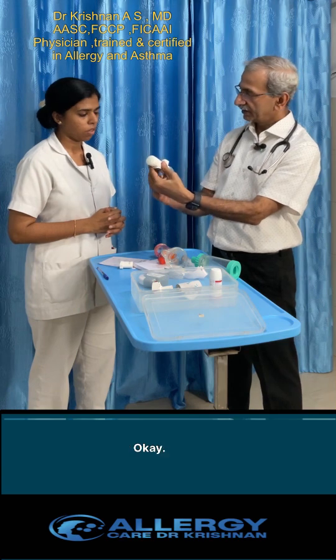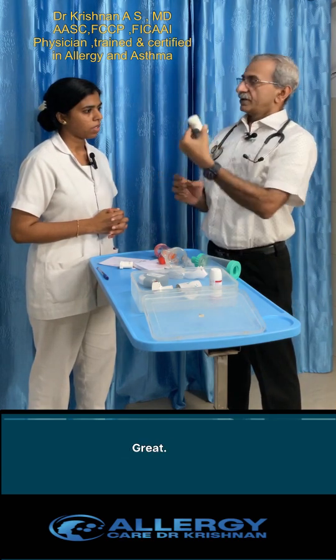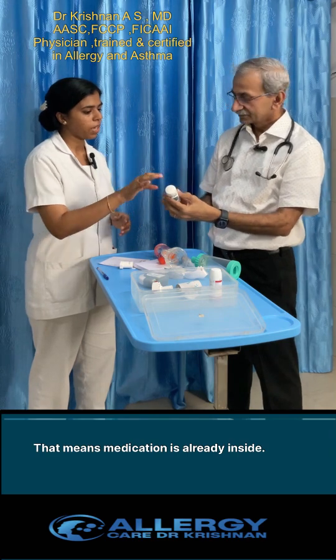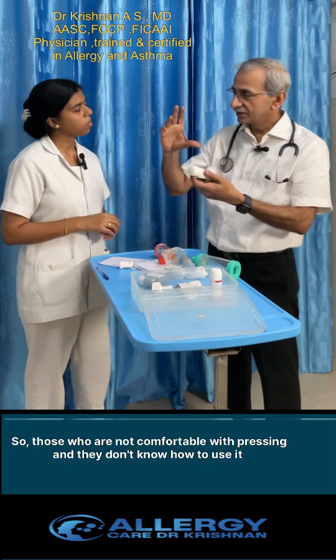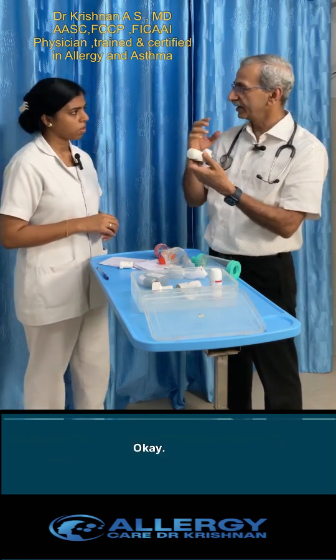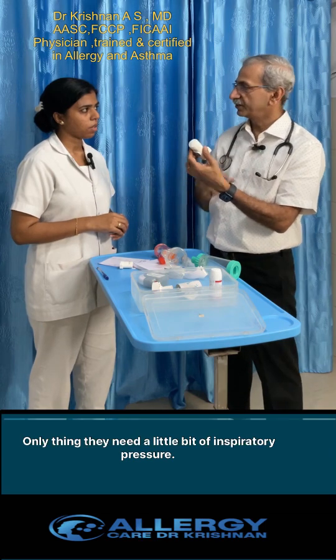Open the cap here and keep it. Breathe in — the medication is already loaded inside, so you don't have to press anywhere. This is much easier for those who are not comfortable with pressing and don't know how to coordinate. You only need a little inspiratory pressure.